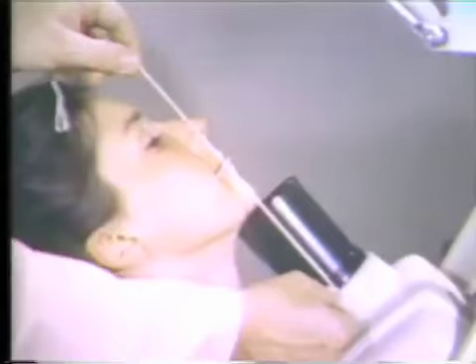This radiograph illustrates a common error in technique. The beam did not expose the whole film. This is another example of cone cutting, and is a common error in this type of occlusal projection. It is usually caused by positioning the X-ray so that the central ray passes through the incisor area rather than through the first molars. On the patient, note the error in positioning. The central ray passes incorrectly through the anterior teeth.